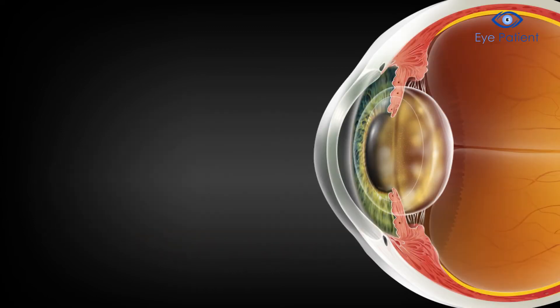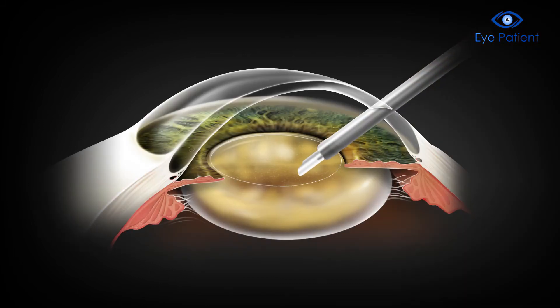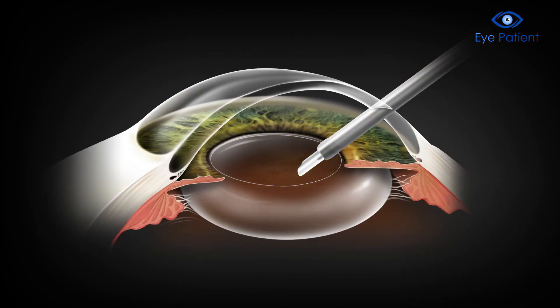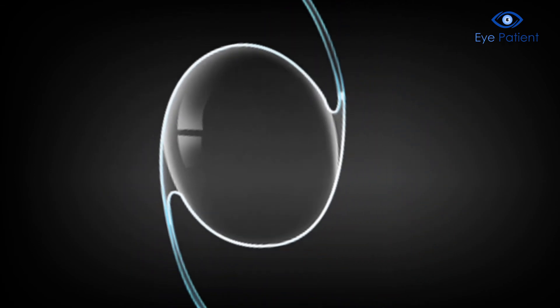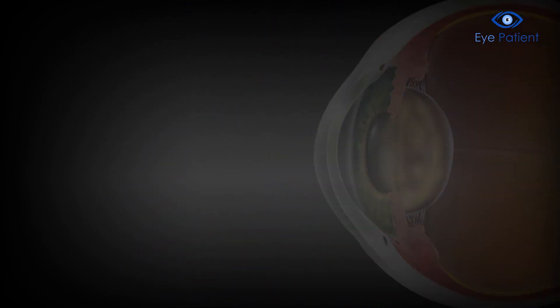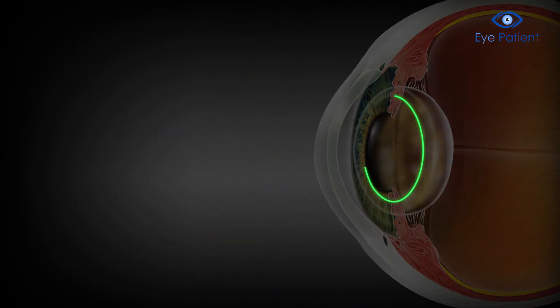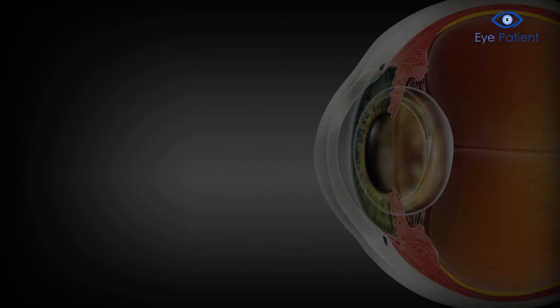The surgeon takes great care to create a window in the capsule's front to enable easier cataract removal and lens implantation. For monofocal lenses, an opening of about 5.5 mm in diameter is ideal to prevent the lens from shifting.